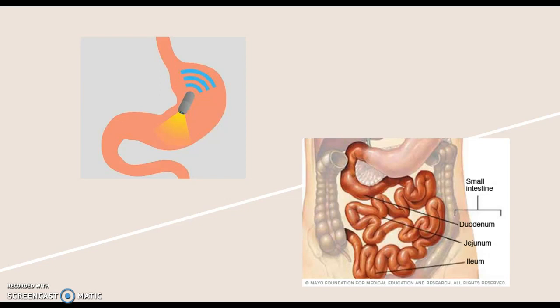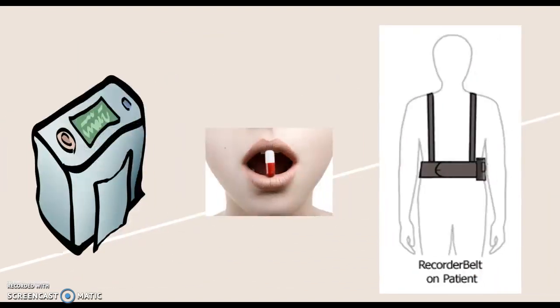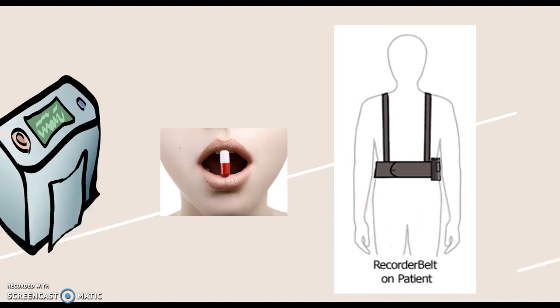During the capsule endoscopy, a person swallows a camera-like pill that passes naturally down the digestive tract, capturing thousands of color images that are transmitted to a recorder that you wear on a belt around your waist. The images saved on the recorder are transferred to a computer with special software that combines the images together to create a video. The pill takes about 30,000 pictures before passing naturally from the body, says Jonathan Darrow from Harvard Law Bill of Health blog. The images help to point out if there are issues and if further tests or treatment needs to be done.